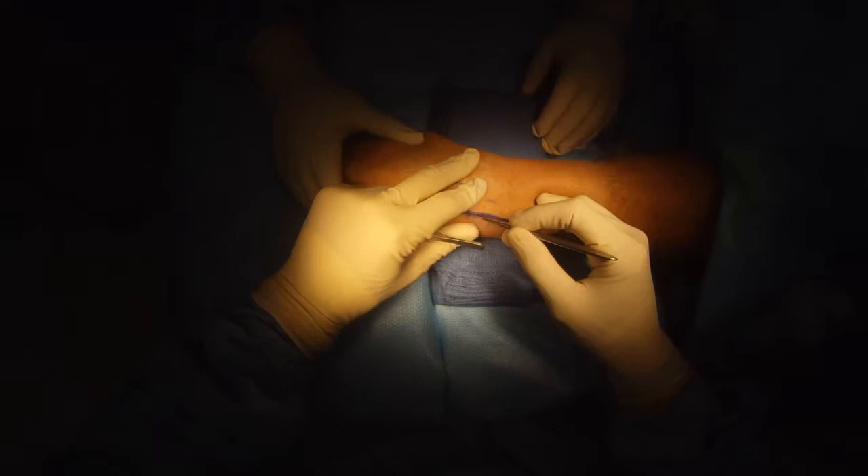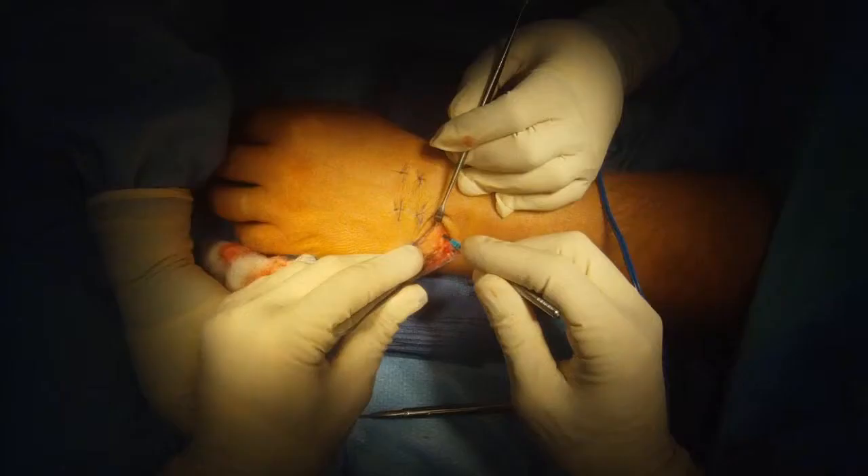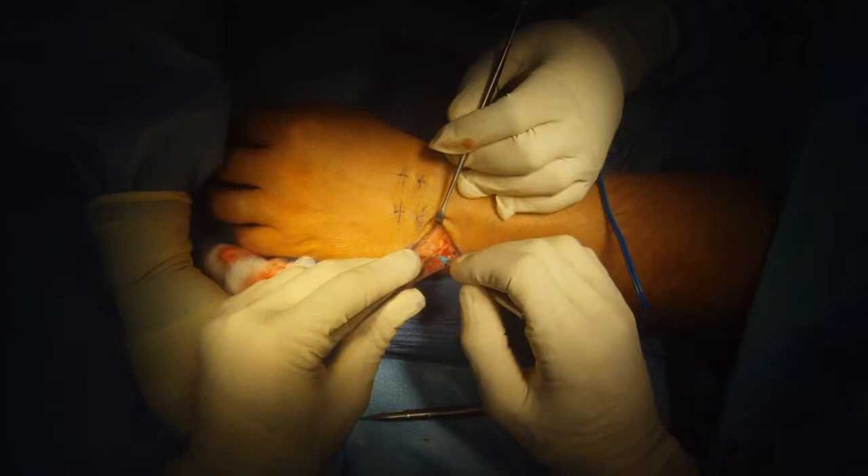Ulnar Shortening Osteotomy. I'm going to make an incision over the head and neck of the ulnar bone, which we're going to shorten a few millimeters.